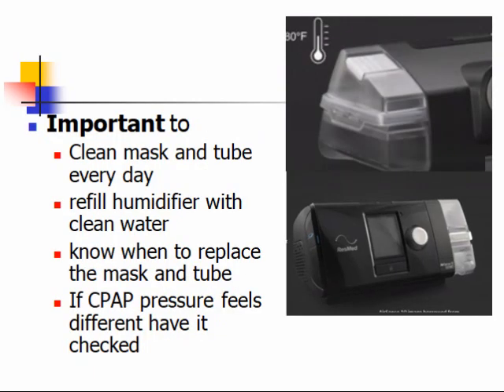It's also important for the patient to clean their equipment, their mask, their tube, on a regular basis. Some say every day. They should refill a humidifier with clean distilled water. They should also know when to replace the mask and tube if they become damaged or aged. If CPAP pressure feels different, they should be told to have a therapist check the unit.